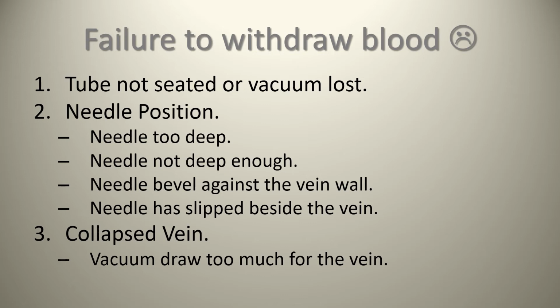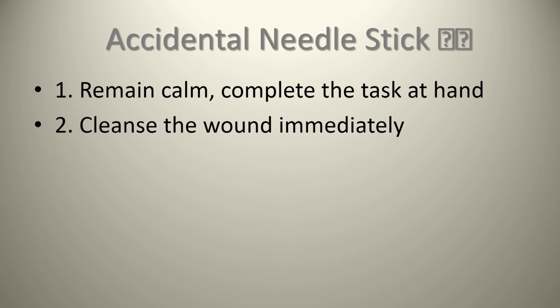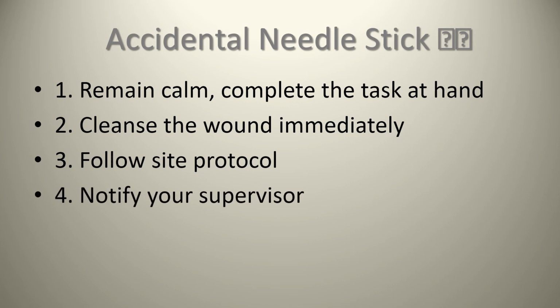Accidental needle stick. If this occurs, remain calm, complete the task at hand. Number 1, cleanse the wound immediately. Number 2, follow your site protocol for needle stick. Number 3, notify your supervisor. Lastly, complete an incident report form.